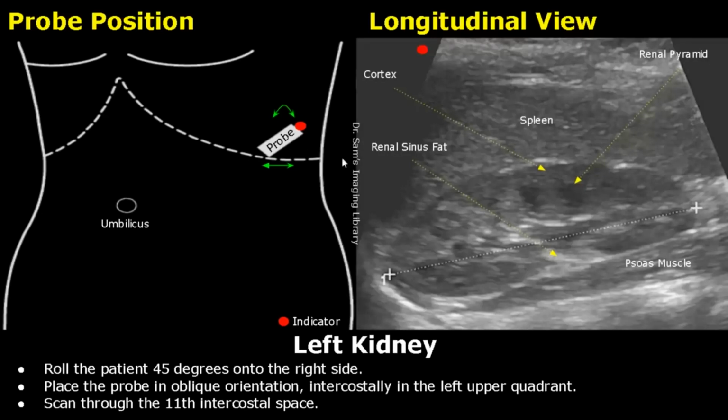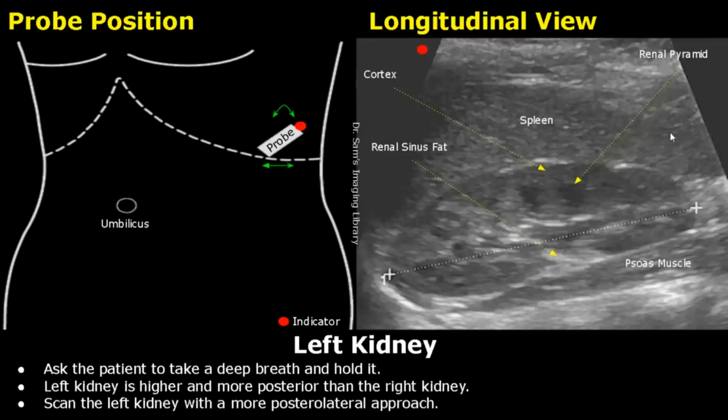Ask the patient to take another deep breath and hold it. The left kidney is higher and more posterior than the right kidney, so try a more posterolateral approach. We will get this type of image.